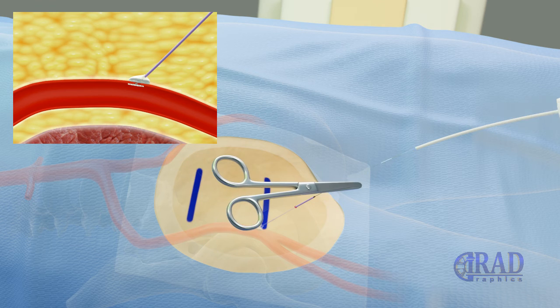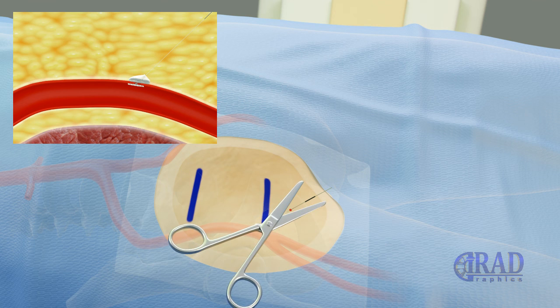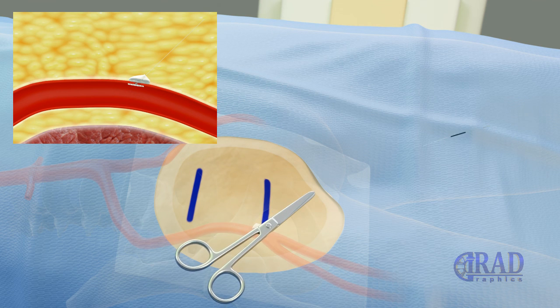Then the string is cut by scissor in the middle part. After removing the middle plastic piece, the rest of the string is trimmed at the level of skin.